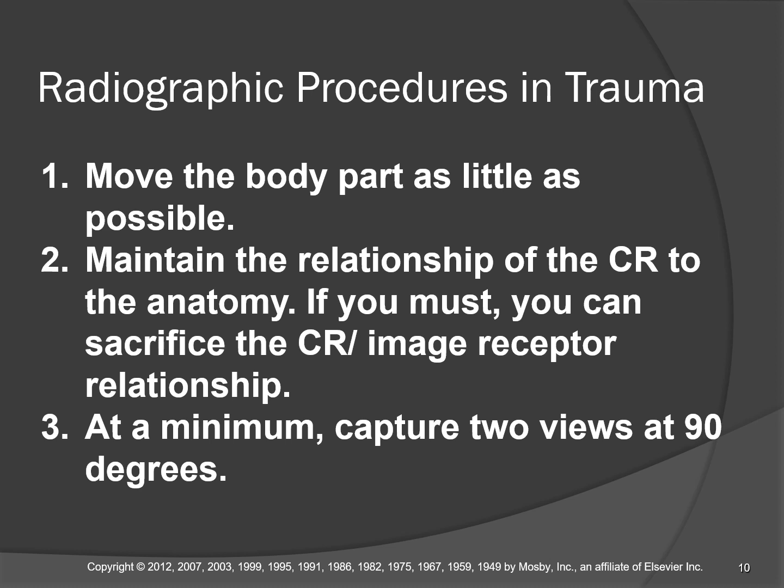So with an elbow flexed 90 degrees, you can get a full series. You can get an AP, lateral, and coyle methods. The AP is going to take you 2 exposures, the bent elbow AP. The lateral is going to take an exposure, and then the coyle method is 2 exposures.